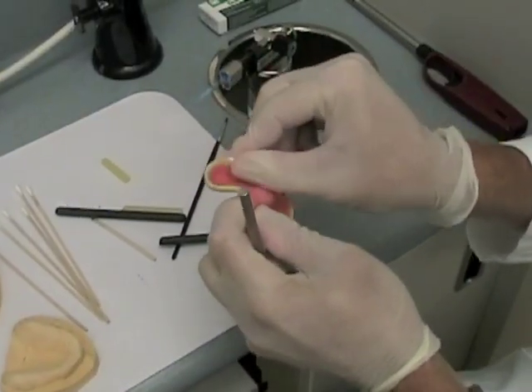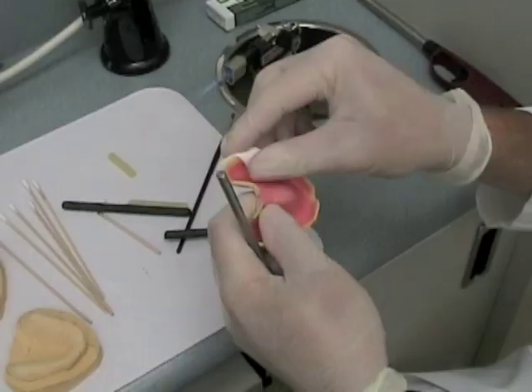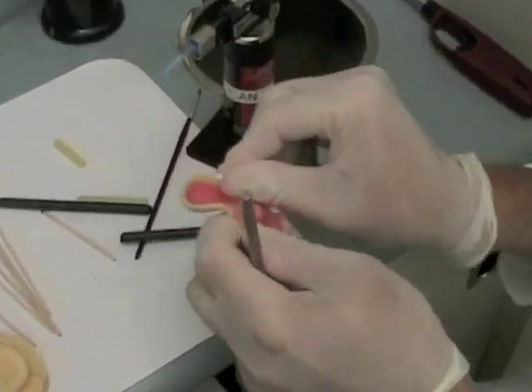Dry the custom tray where you will add the modeling compound to the edge of the flange. If you don't, the compound may not stick to the tray.